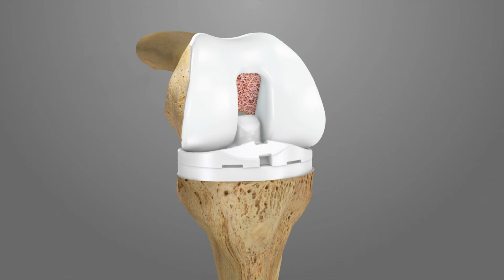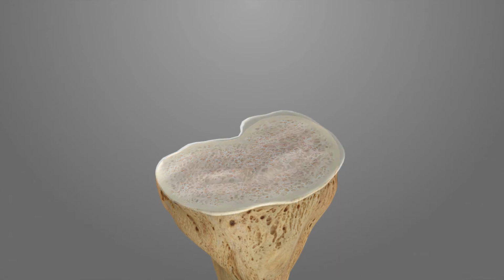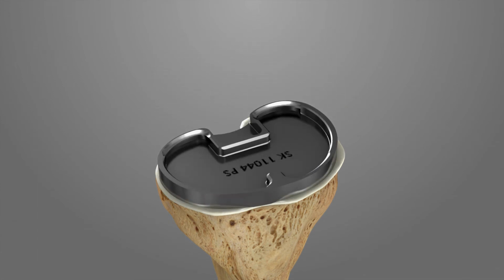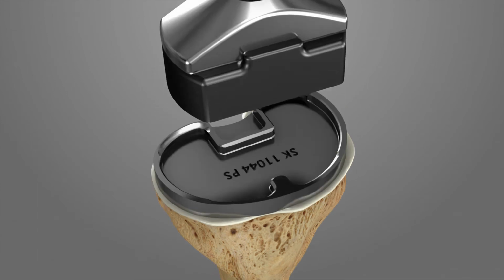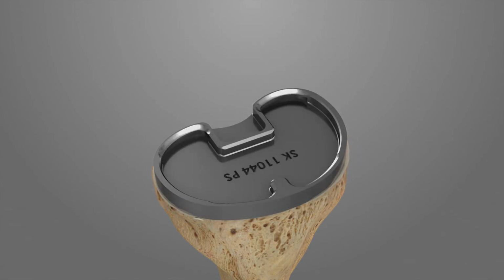In the event soft tissue balance or joint alignment cannot be achieved, ligament balancing using standard soft tissue releases may be considered. Once optimal balancing and tensioning have been achieved, proceed to cement the implants. Thoroughly wash and dry the bone prior to cementing. Apply a layer of cement to the cut tibia and the tibial tray with less cement posteriorly. Impact the tibial tray. Remove any residually extruded cement from around the tibial tray, with consideration for any cement that may have extruded posteriorly.